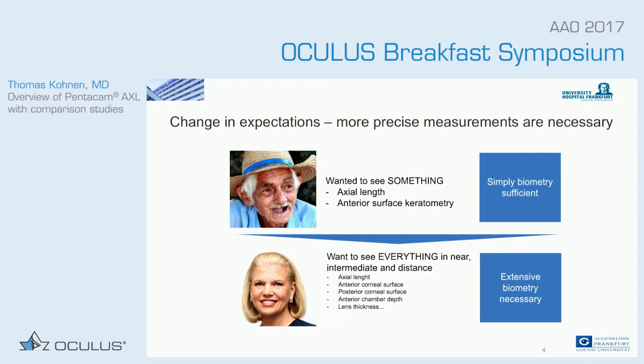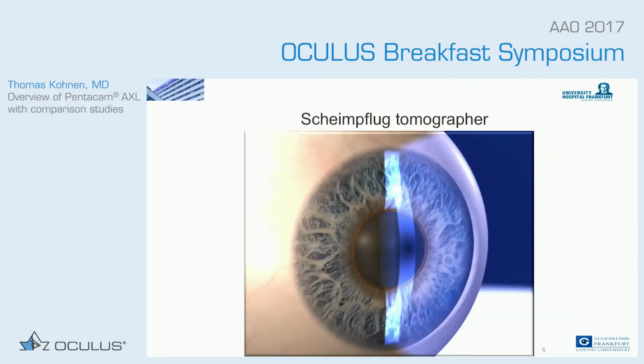The expectations have gone up, particularly when you look at the premium IOL area. If you have premium IOLs, for example presbyopia-correcting, patients need really extensive biometry because you need to have a good outcome. And the more we can put into the preoperative evaluation, I think the better the outcomes will be.